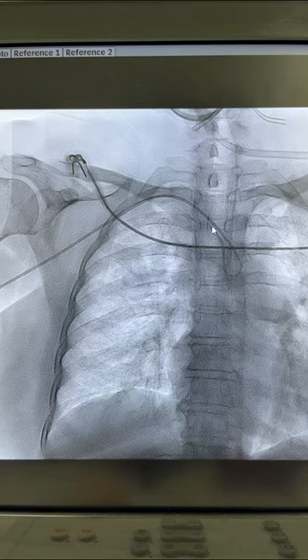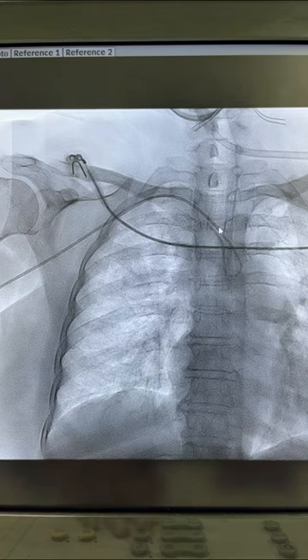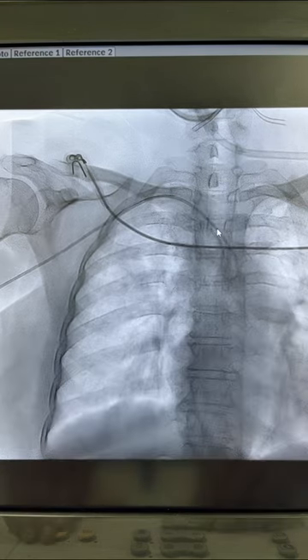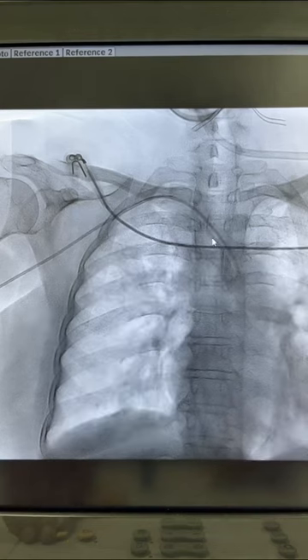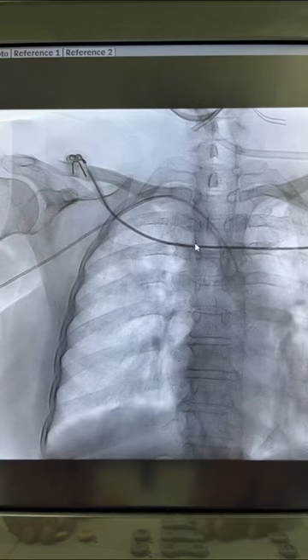Now you can see the curve is pointing in this direction. Just pull it back. The precaution that has to be taken is that if you pull it back in this position, it might go into the subclavian artery.